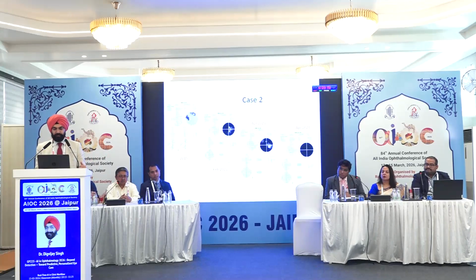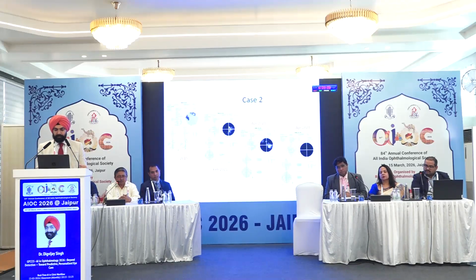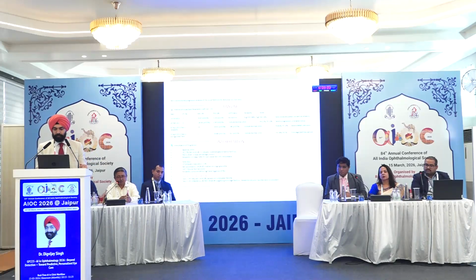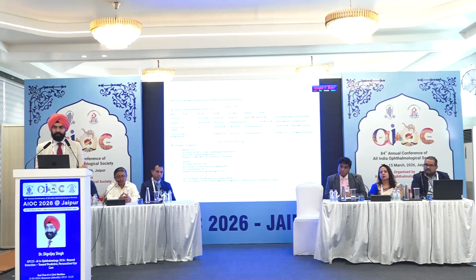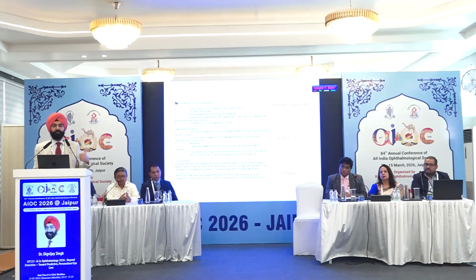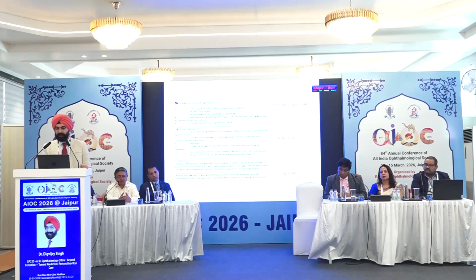The same you can do with visual fields. See here, we put this visual field test, and if you see here, two of the fields are of a very similar time frame as compared to the earlier. So again, it'll put the values down, the mean deviation, pattern standard, all this it is doing on its own, and it interprets that there is a visual field progression that has happened over time. It also tells you that it's a fast progressor, and this would require treatment. At the same time, it will also sometimes guide you in terms of what the treatment or IOP should be. So the more parameters you give it, the more it will pick it up and tell that for you.